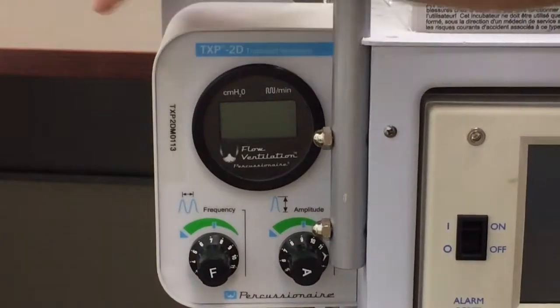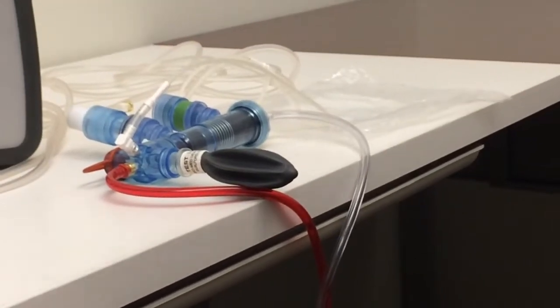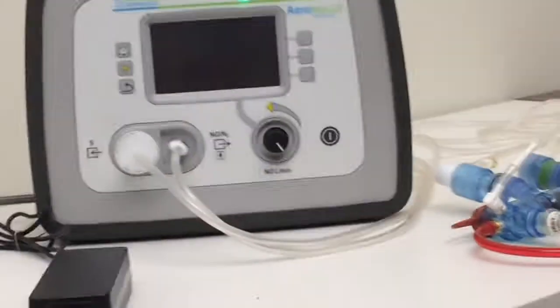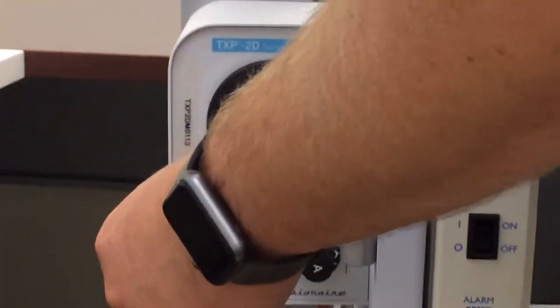Just to give a recap: we've got our vent circuit hooked up, we've got the gas ready to turn on, and we've got the Aranox ready to turn on. What I usually do is start the vent first, just so we can start some gas running through the circuit.